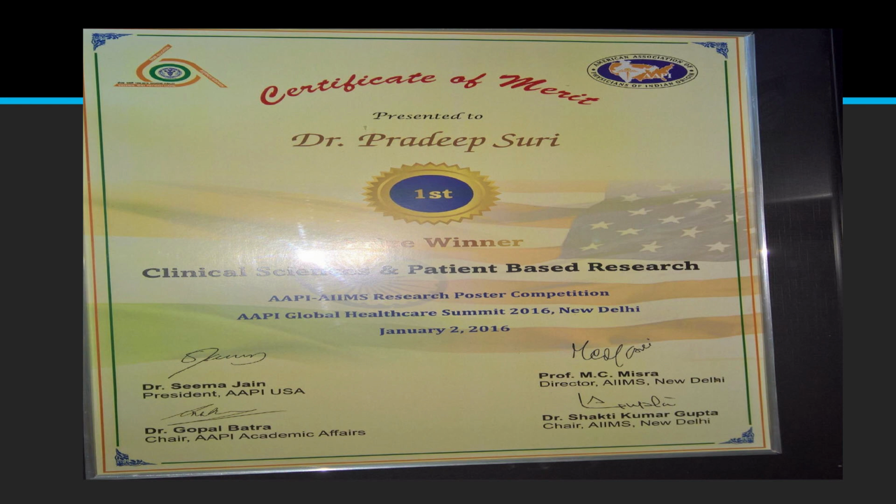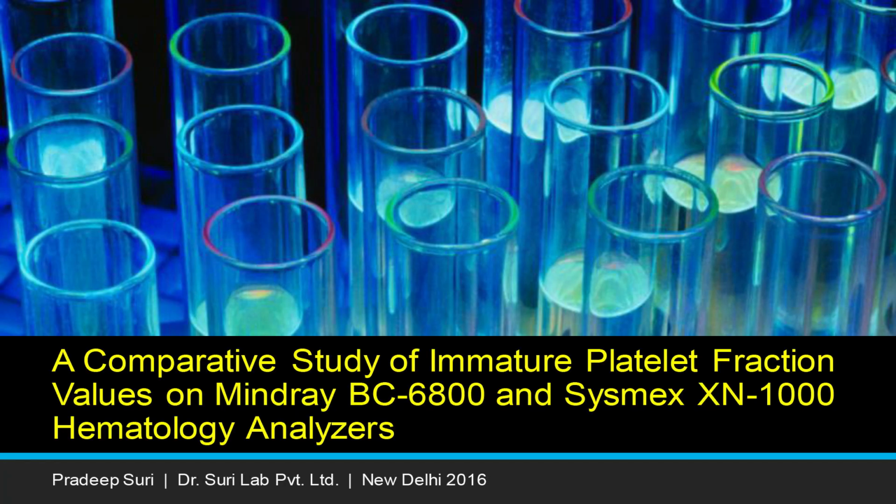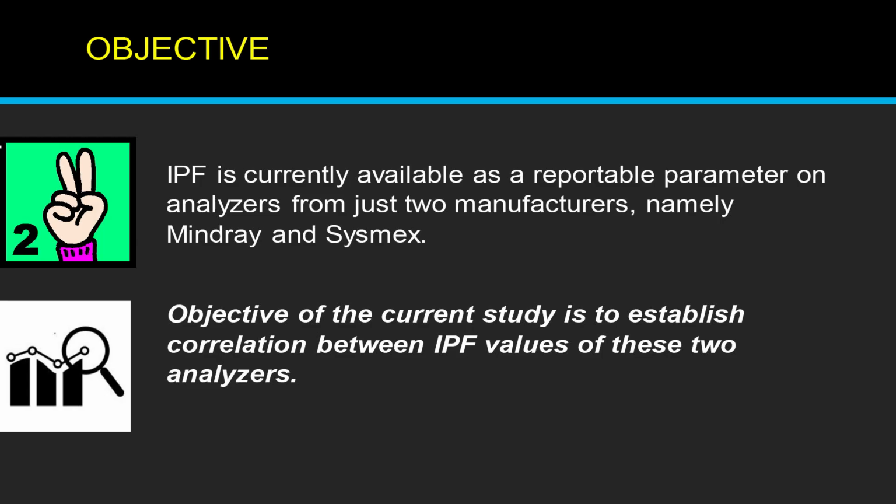So, encouraged, we then tried to do another study in 2016 in this same state in Rajasthan. We did a research paper in RNT Udaipur. There was a competition. And we did a comparative study on IPF on Mindray BC 6800 with Sysmex XN-1000, which were the two most common analyzers doing IPF at that time. So we wanted to see whether IPF values from both the analyzers showed some correlation or were totally discordant with each other. So we tried to evaluate the IPF parameters of these two analyzers.